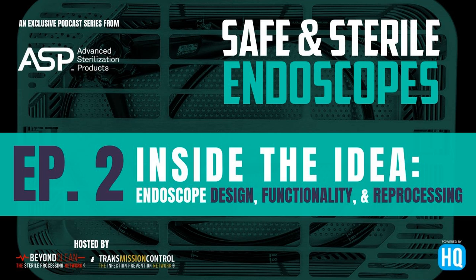And when we came up with the ECR, the endoscopic cleaner and reprocessor, that's where, okay, I don't feel good today and I'm a technician, but I'm going to clean this scope, but I'm not doing it to my best ability. Now I've got that automated system that's going to repeat everything I did or did not do correctly at the sink. That's the beauty of having that insurance policy, if you will, for I know that it's going to get done. It's a redundancy. And we know redundancy, again, is going to reduce that microbial load.